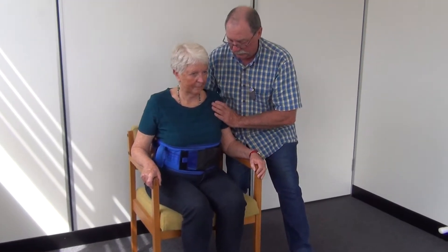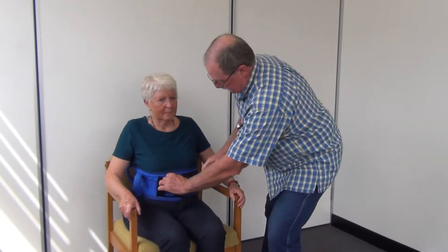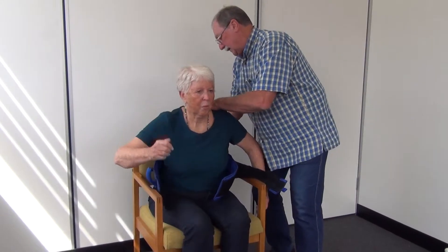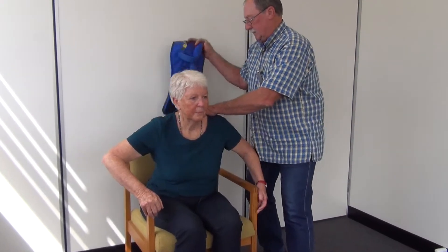Lovely, thank you. Wiggle your bottom back. Take our belt off. Lean forward a little — thank you. Bring it through.